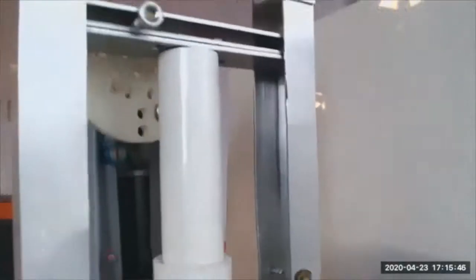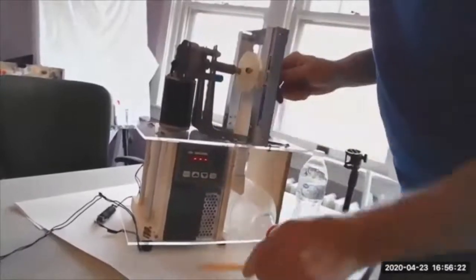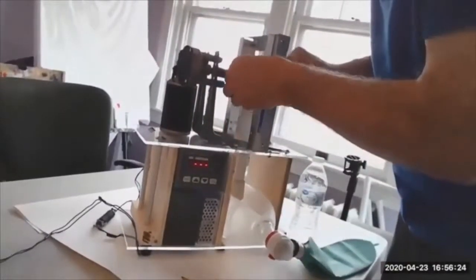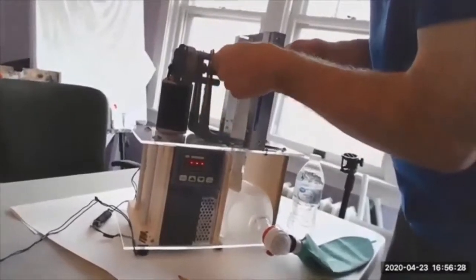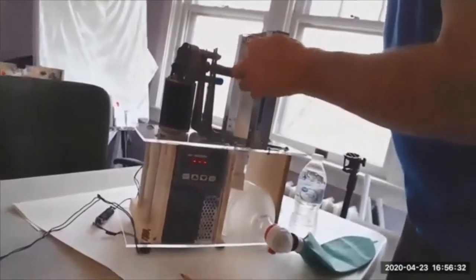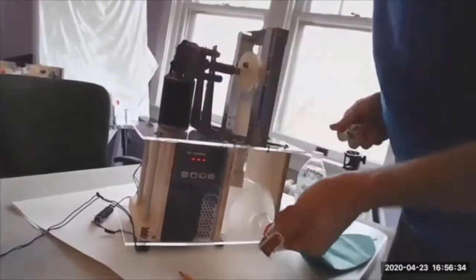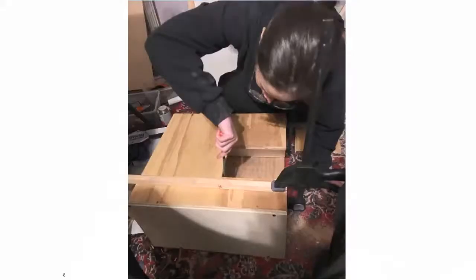So we adjust the frequency of the sine wave by the digital controls, and then the amplitude, which corresponds to the respiratory depth, is controlled just simply by moving this pin. So you just simply relocate the pin to a different location. You simply adjust the amplitude of the sine wave for the respiratory depth. And that's basically how that works.